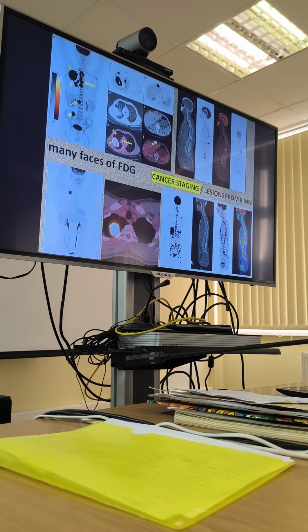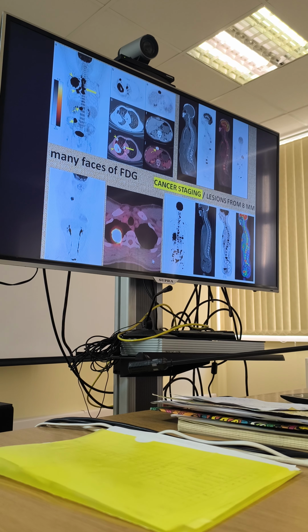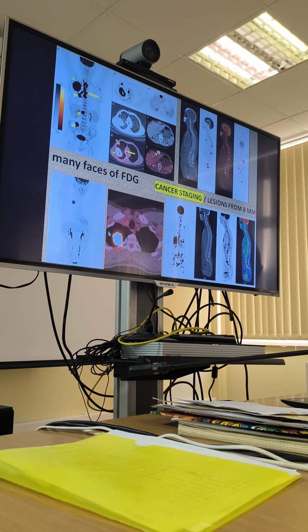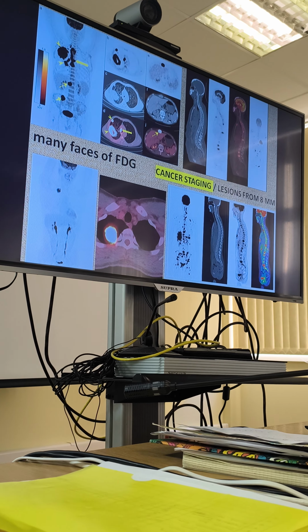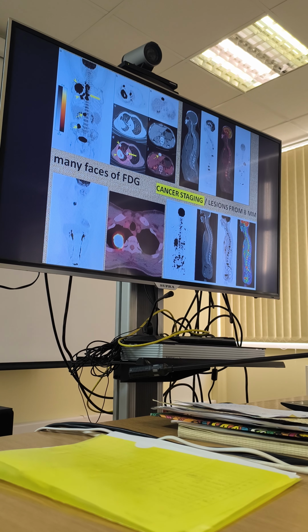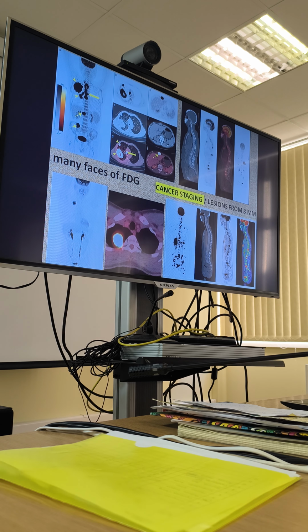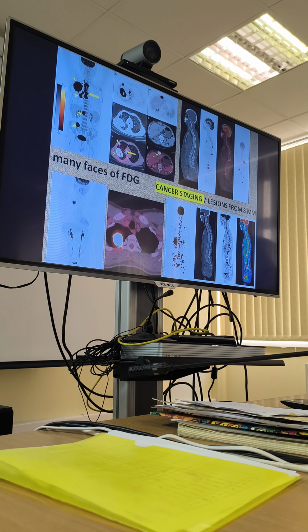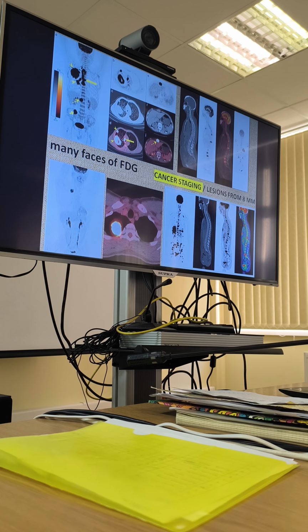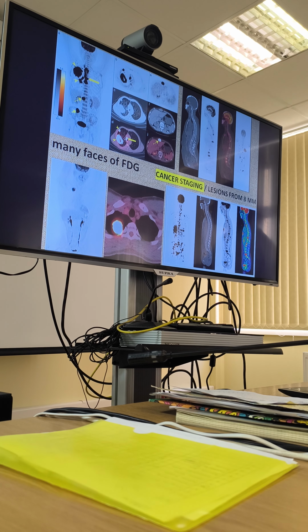Below one, this bottom one, see, this is the tumor, and this is the fused image, so we see the tumor itself, and it's taking up this FDG in a high degree. And this is, remember what we named special 3D reconstruction, which is maximum intensity projection, which is like a summary picture for a PET study. And what do you see on this picture? Like normal distribution and this tumor, and no more, no metastasis.